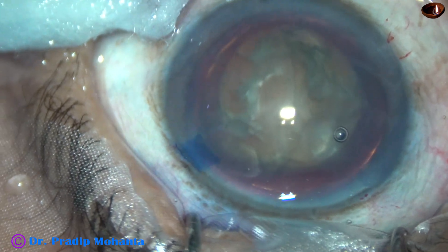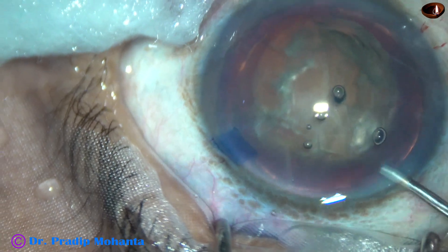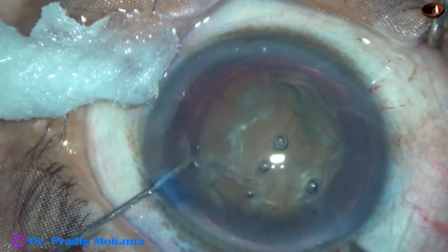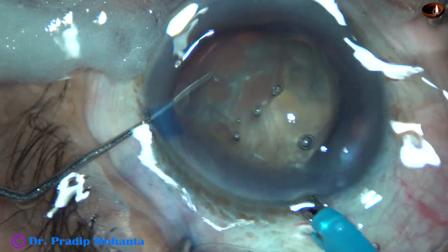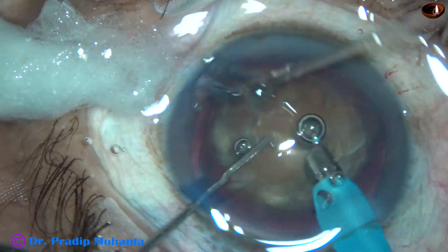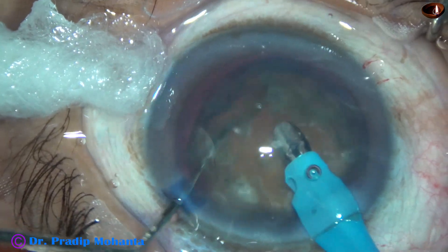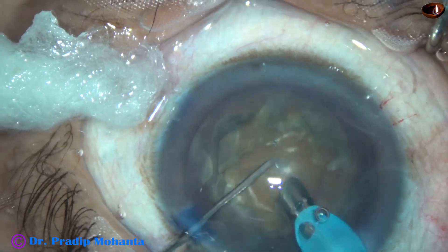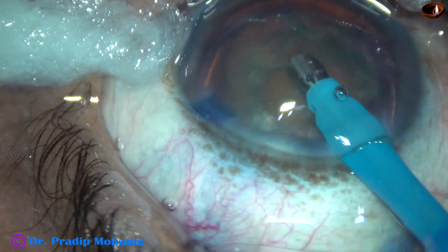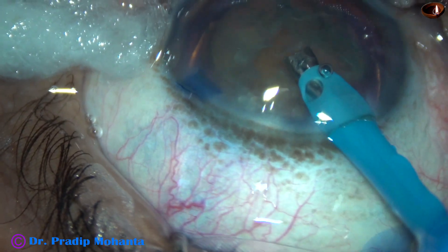I am going to rotate the nucleus after introducing the phaco needle. Watch the exposed part of the phaco needle — it is about 2 to 2.25 millimeters. This is because the cataract is hard and I am going to use my technique, which is called submarine jaw. The handpiece has been turned and the bevel of the phaco needle is up towards the cornea.